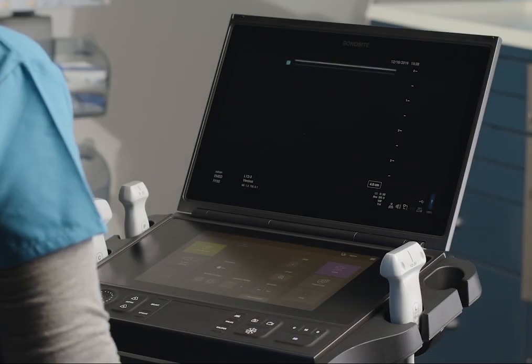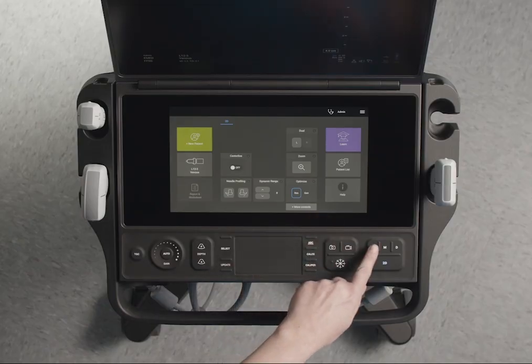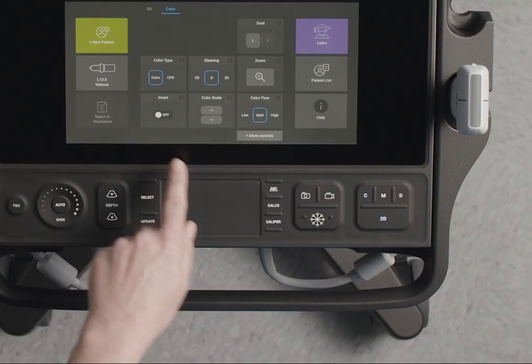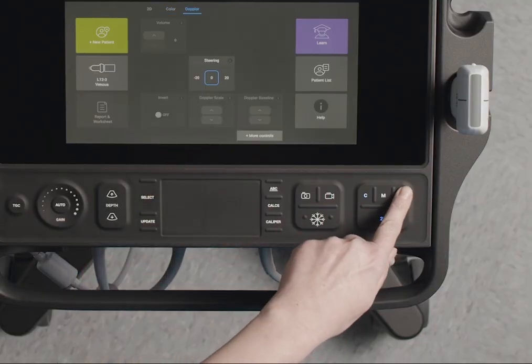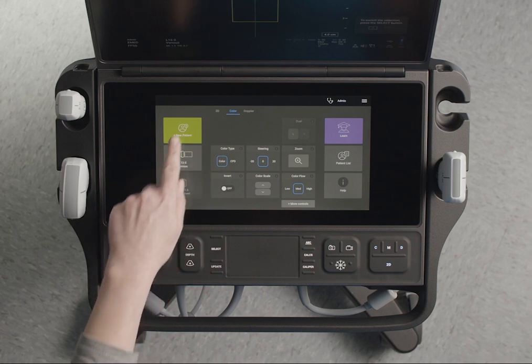The options available to you in the touch panel depend on what you're doing on the system. If you change from 2D to color, the imaging controls available to you also change. They change again if you press D for Doppler. You can use the tab controls to access imaging controls for each mode.